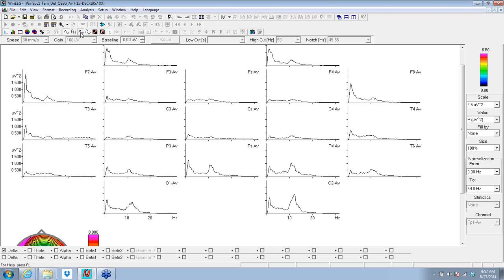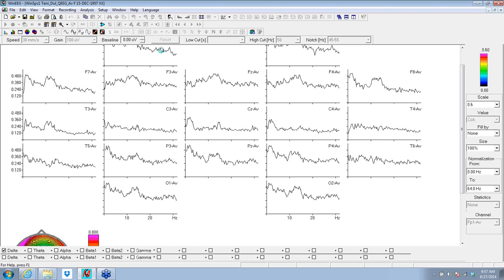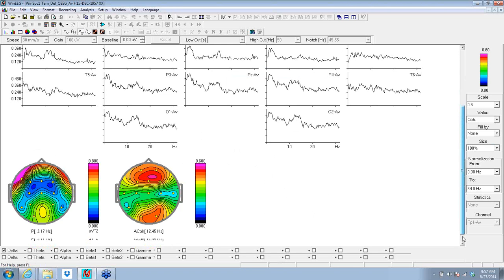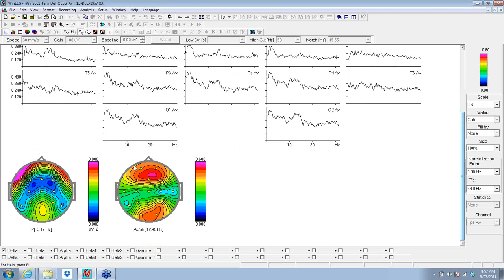It's a bit off. The coherences don't stick up as an isolated peak, but the faster alpha is basically what we're looking at. And we get to just above 0.5 here. So it's a touch high on coherence, and there may be a depression overlay on top of the clinical presentation that's being mistaken as a dementia. And the fast alpha here, SNRI should be avoided because we've got fast alpha, but an SSRI could be considered. DC stim or EEG training to perk up the frontal lobe, and especially to deal with slower content in the dorsolateral frontal areas would end up being of benefit.